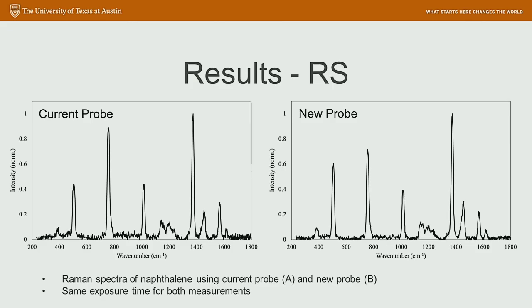We also took measurements to characterize the Raman performance on naphthalene, which is a well-known Raman standard. And you can see with both probes that we're able to collect spectra that look pretty similar, with the 4 distinct peaks of naphthalene showing up in both probes. So these are encouraging results.